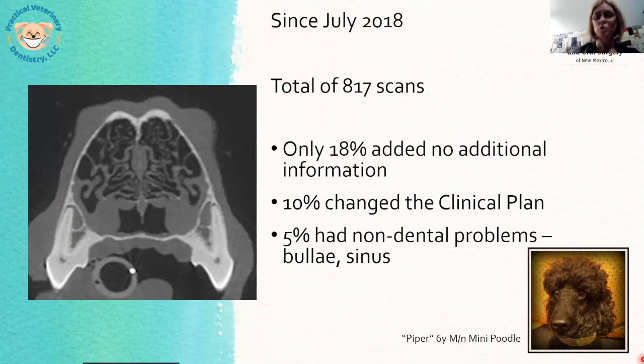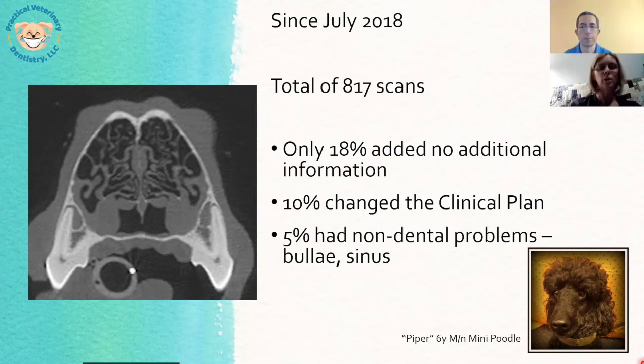I've been using it and I will continue to do scans on every single dental patient that I have to get the most information and make the most use out of it. So I appreciate your time listening to me. I hope this has been helpful on how you can see that we are using it in our daily dental practice. Please feel free to ask me any questions that you might have, and I'm going to turn the video and the audio back over to David Sarmet from Xoran.